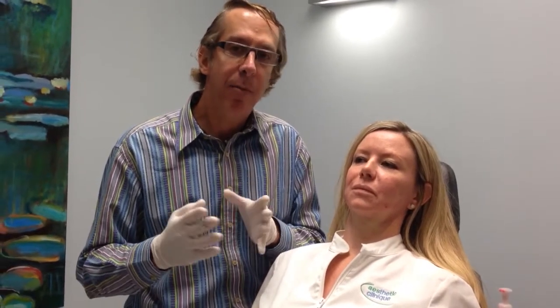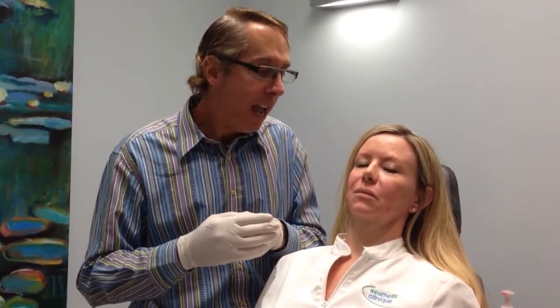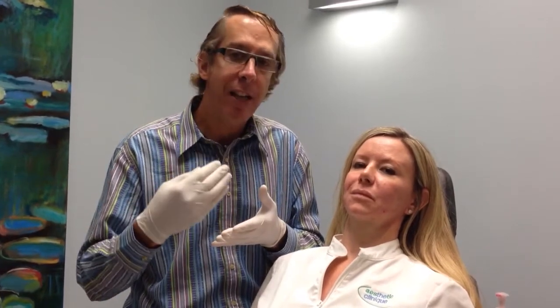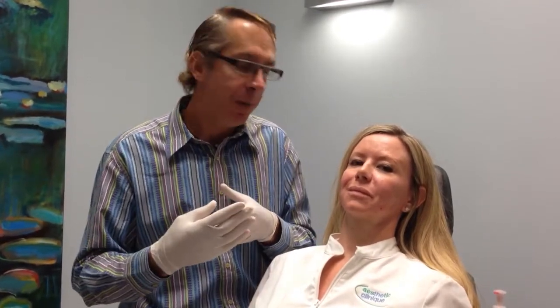So Artefill is made up of a combination of collagen and PMMA, polymethyl methacrylate. Polymethyl methacrylate is an inert substance, which means it doesn't get degraded by the body, and it stays there and creates a collagen response by the body, and that's what gives you the long-lasting fill.